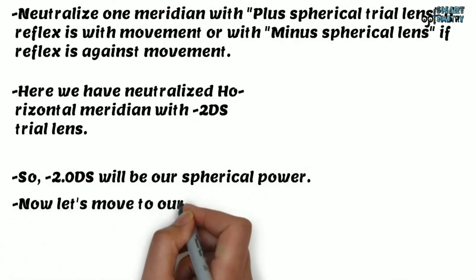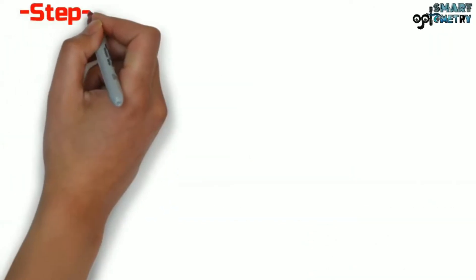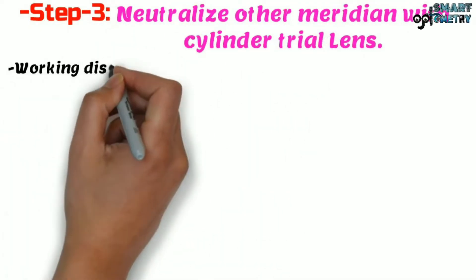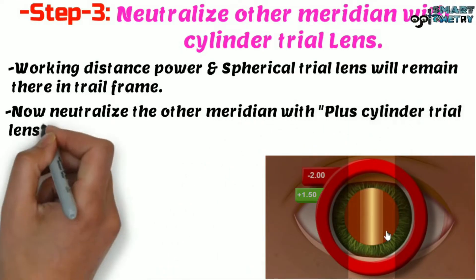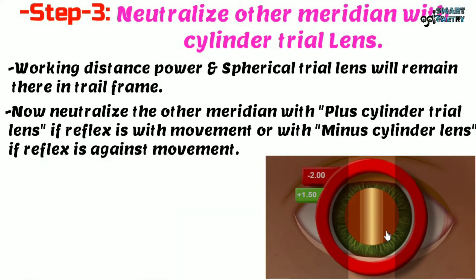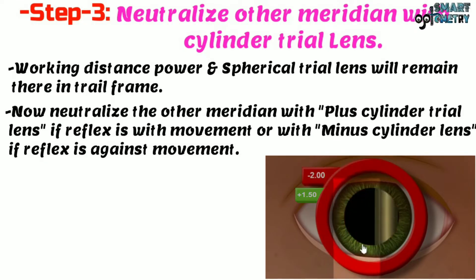Now let's move to Step 3 to identify cylinder power. Neutralize the other meridian with cylinder trial lens. The working distance power and spherical trial lens will remain in the trial frame. Neutralize the other meridian with plus cylinder trial lens if reflex is with movement, or with minus cylinder trial lens if reflex is against movement. We will neutralize the vertical meridian with a cylinder trial lens. The movement here is against movement, so we will neutralize it with minus cylinder lens.